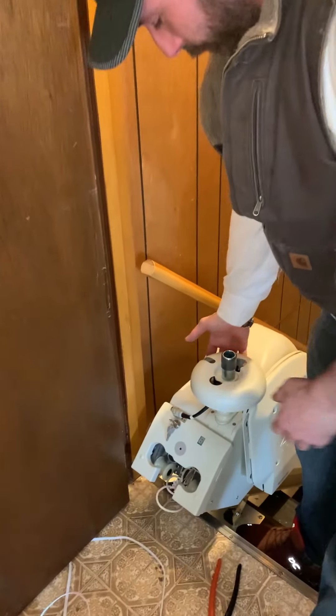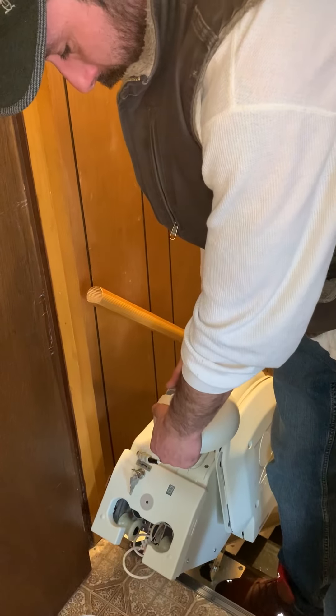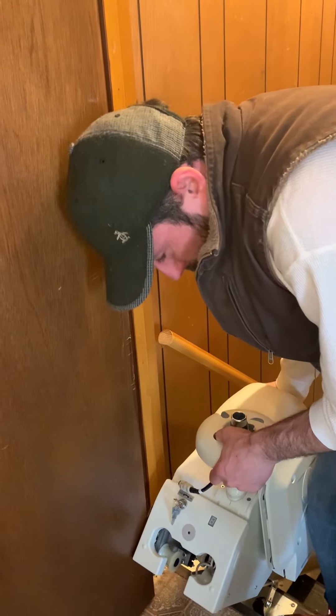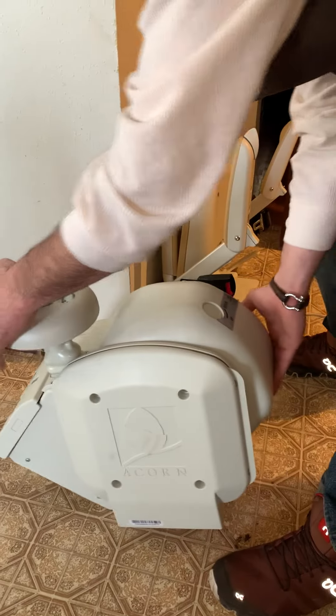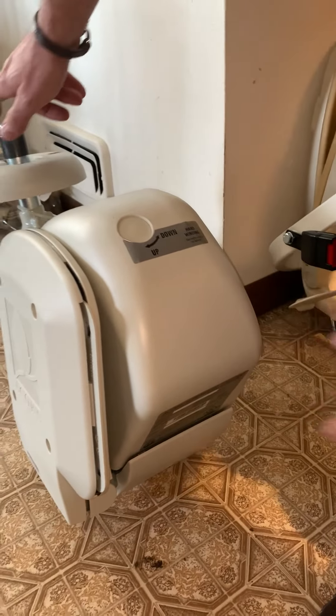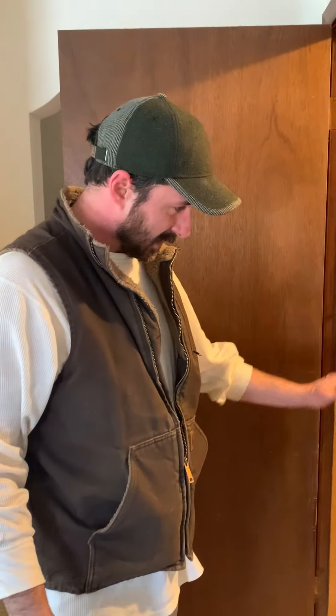Grab the unit from the collar here and come straight off with it. Hold the back a little bit. Come straight off and set it down just like that. The rubber could crack on the back so you got to be careful. That's it. Now we're just going to take the whole rail out as one piece and that'll be it.